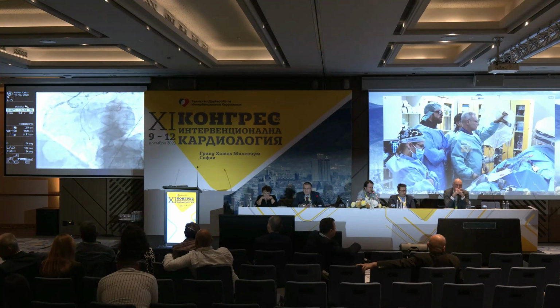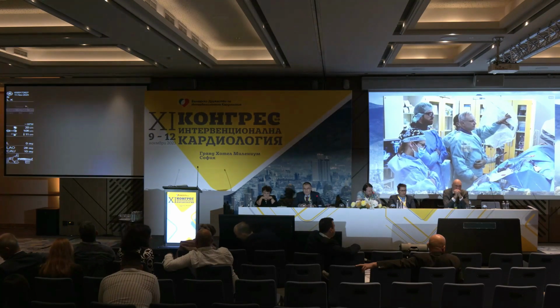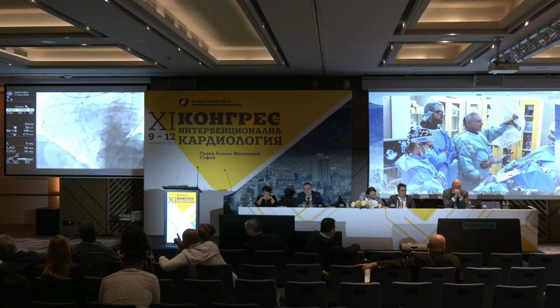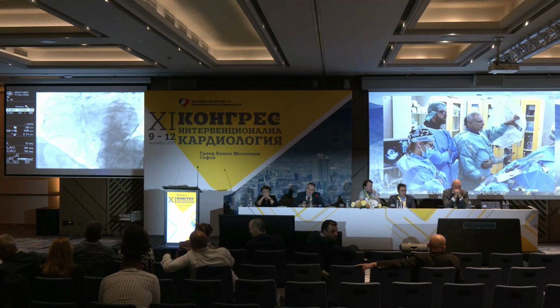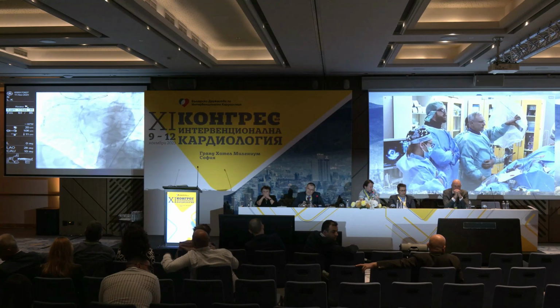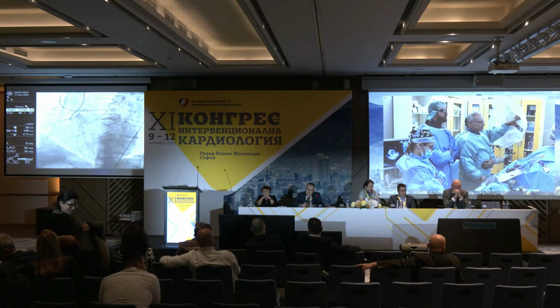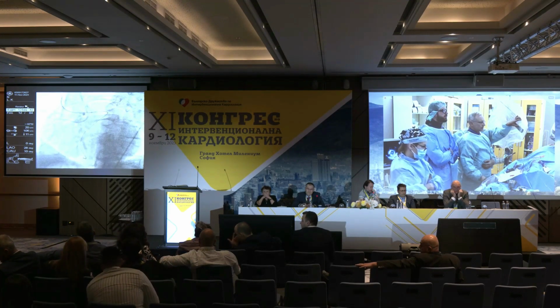Which was the projection that we saw that? Maybe it's the compressed hematoma, because you see that there is some contrast there on top, correct? Because the initial wire was very wrong. A little bit back, Dr. Gelev. You're looking at the vessel before that.